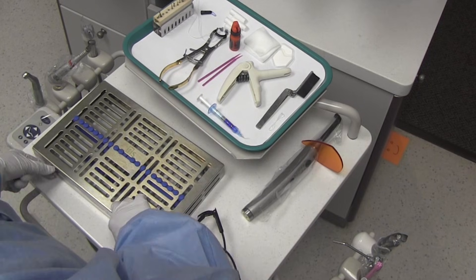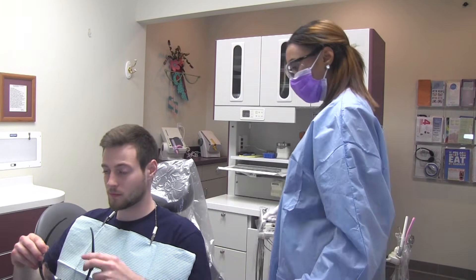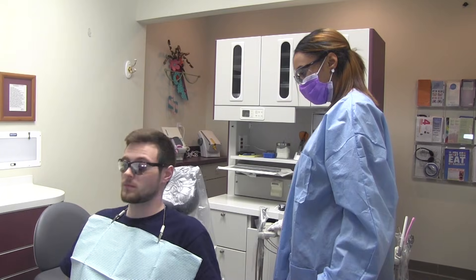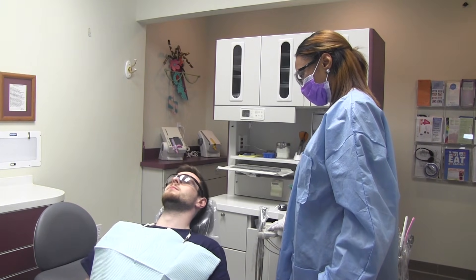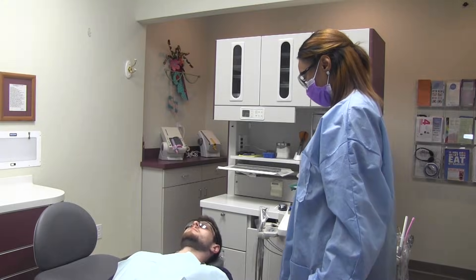Always open sterile packs in front of the patient when possible. Make the final adjustments to the dental chair. There should be approximately 12 to 14 inches between the patient's face and the dentist's face. Provide the patient with protective eyewear.